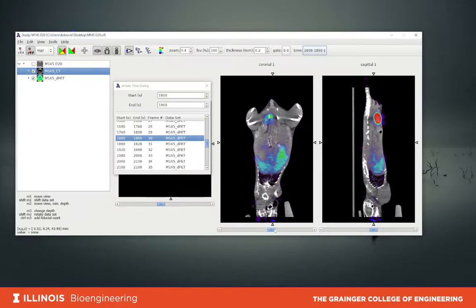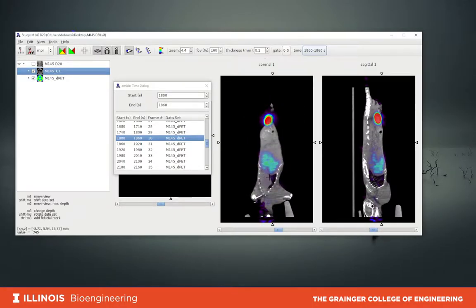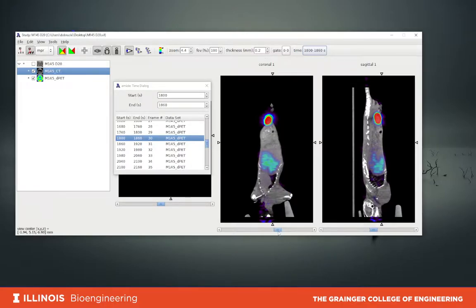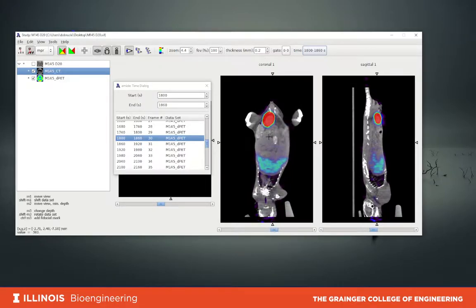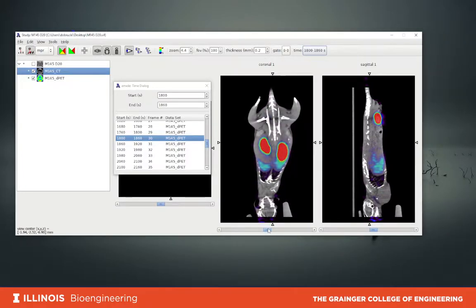This is the liver. Looking at the heart, we can see it already has very small activity, but we see very high activity in the blood. This is the bladder. Most of the radiotracer injected about 30 minutes earlier ended up in the bladder, and there is some accumulation in the liver as well as in the kidneys.